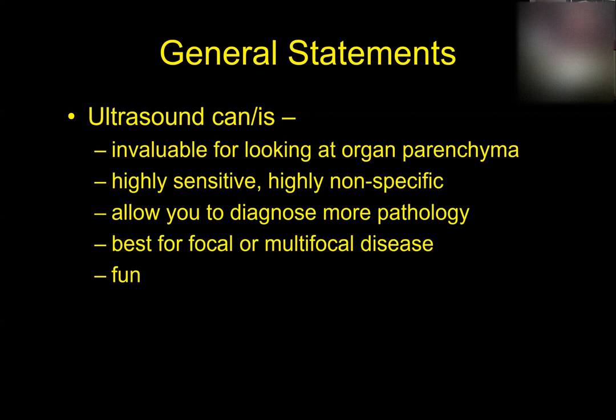On the other hand, ultrasound is really, really good for looking at the parenchyma of the organs. So if we have a small nodule inside the spleen and it doesn't bulge the capsular surface, you would not be able to see it on radiographs. Most of the time, notice I didn't say all the time, but most of the time, you will see that on ultrasound. So the great thing about ultrasound is it's really good at looking inside the organ parenchyma, because radiographs really can't do that.